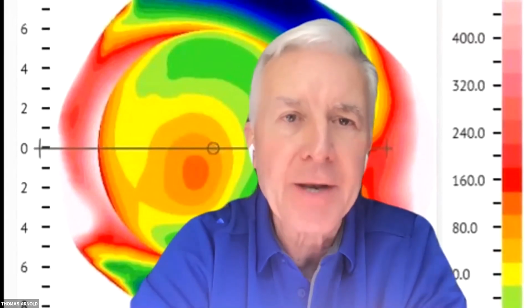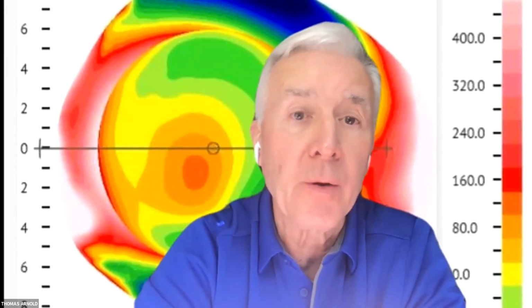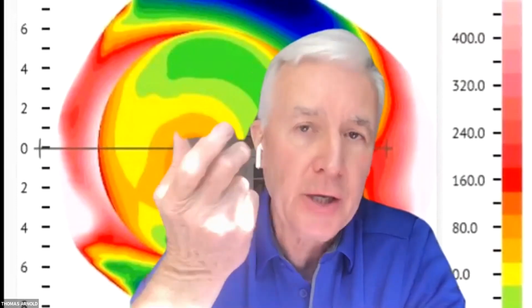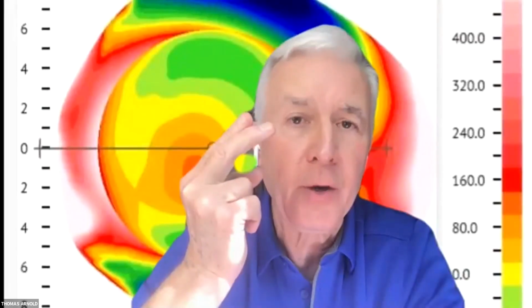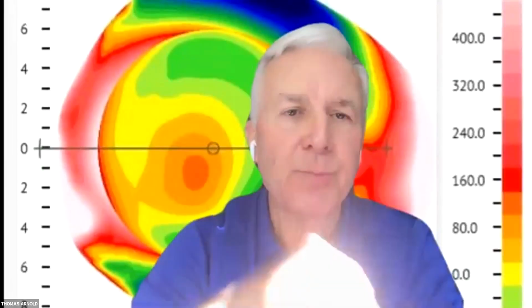And so I don't think it extrapolates directly into the data, but again, it gives me a good idea of where the scleral state is. And I do think we're working with VS to link those two, because as you well know, the VS uses tangent angles and haptics. So I don't think they're coordinated right now, but they're working on it. So yeah, I think it's a useful kind of second map to go, yeah, this makes sense.